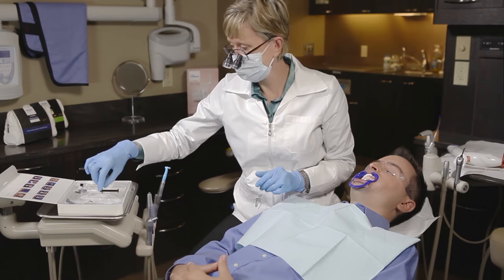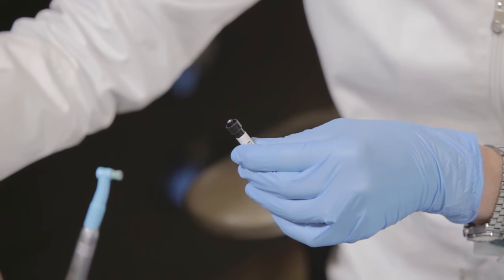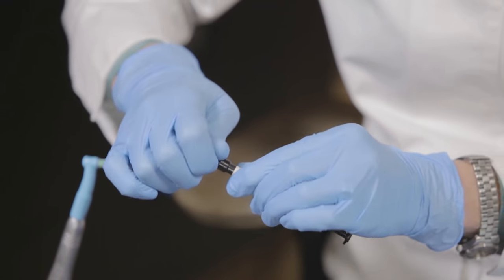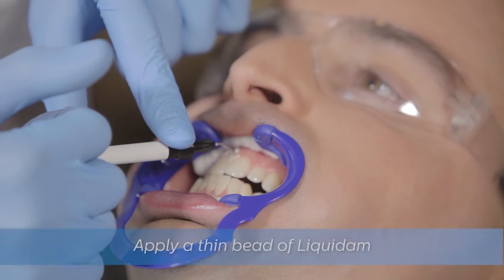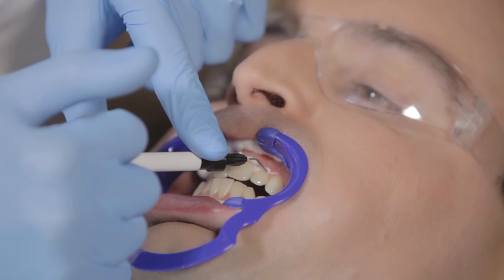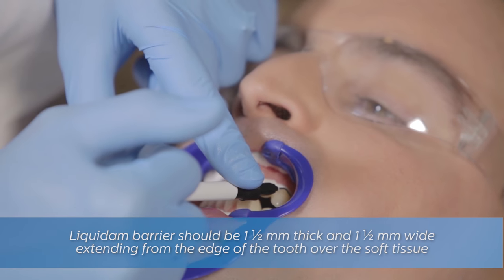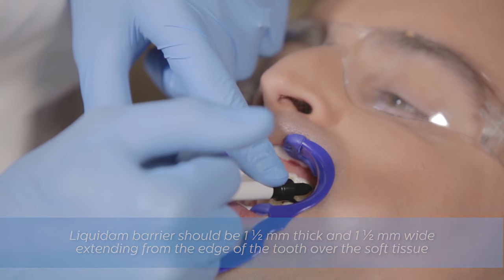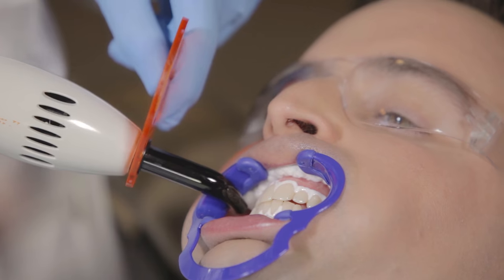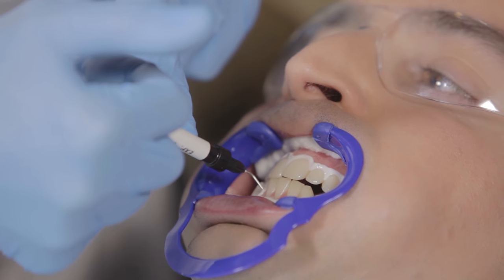Dry the gums and teeth. Next, twist off the cap on the Liquidam syringe and attach the metal tip. Apply a bead of Liquidam along the gingival margin, being careful to cover the exposed gum along the margin to help prevent any sensitivity. The Liquidam bead should be approximately 1½ mm thick and 1½ mm wide, drawn down to cover the papillae. When finished, cure the Liquidam for 3 to 5 seconds using a sweeping motion to prevent excessive heat against the soft tissue. Then repeat the Liquidam application on the lower teeth and utilize the same curing method.